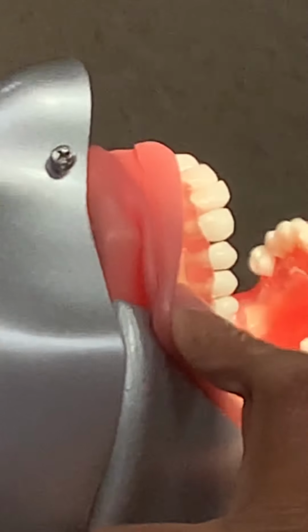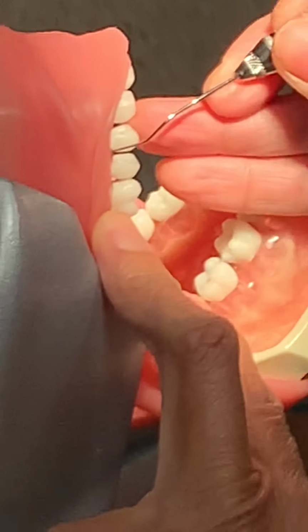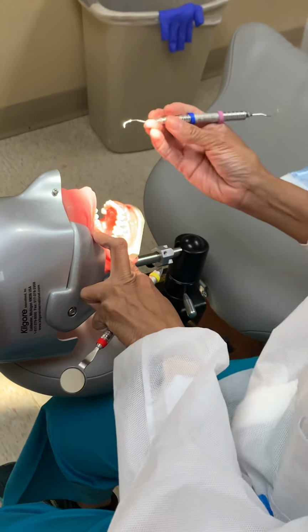Terminal shank parallel. So this is my terminal shank right here. So we use the premolar. It's kind of hard to keep this mouth open. So I'm going to use the premolar. And my terminal shank is parallel, and so my handle is coming out of the patient's mouth. Once again, yes, I can make it parallel with the wrong end. But if you think about it, look at my wrist, it's all bent here. My handle is going back into the patient's throat. And this is not how we practice, not good ergonomics, okay? So we want to think about our ergonomics.